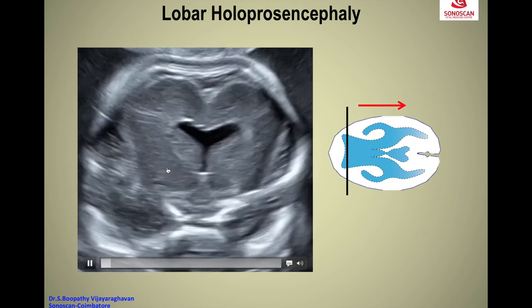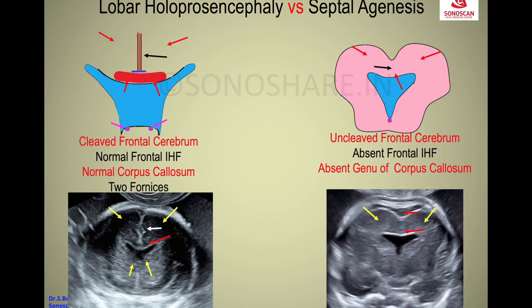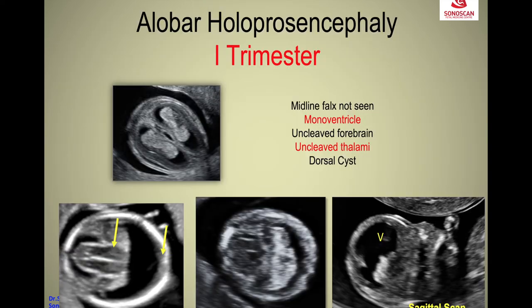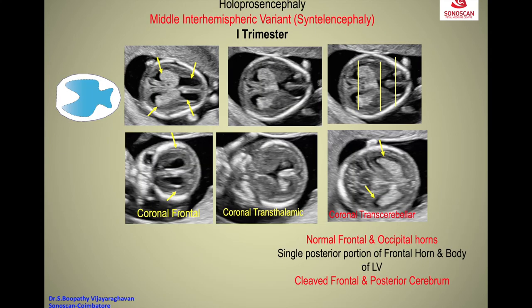In the occipital region there are well-cleaved occipital lobes with two columns of the fornix. The single ventricle shows absent septum pellucidum with a single posterior portion of the frontal horn. The anterior frontal horn is separate, whereas the posterior monoventricle is shown by V. There is a dorsal cyst; the frontal and occipital lobes are cleaved whereas centrally the ventricle remains single — this is the middle interhemispheric variant.